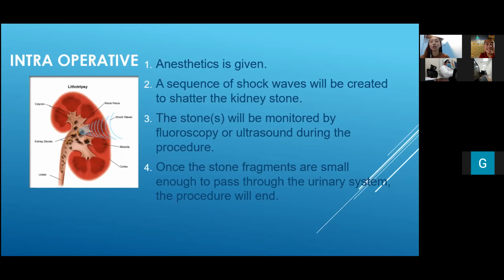And a sequence of shocks will be given to shatter the kidney stones. The stones will be monitored in real time by our fluoroscopy or ultrasound during the procedure. During that time, we will just monitor our patients, the vital signs of our patient, and we will render any help to our anesthesiologist.